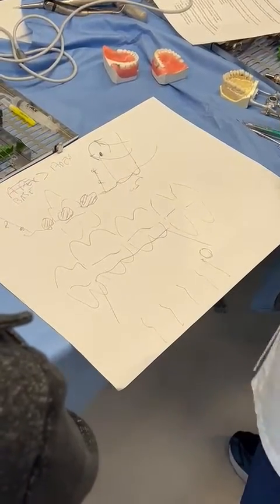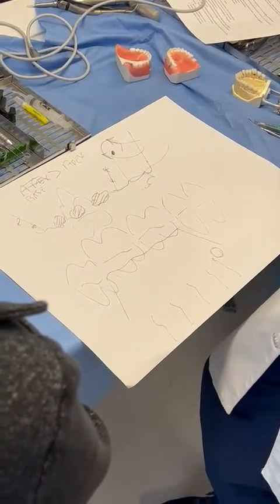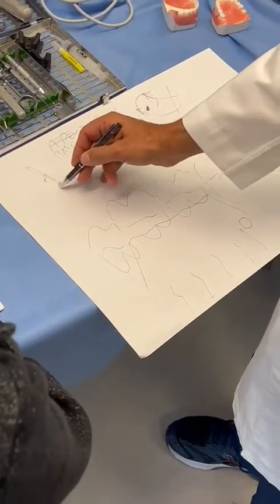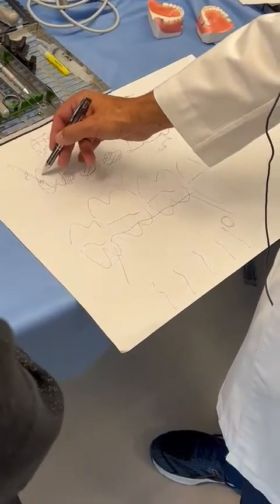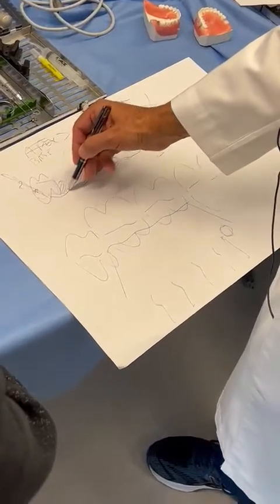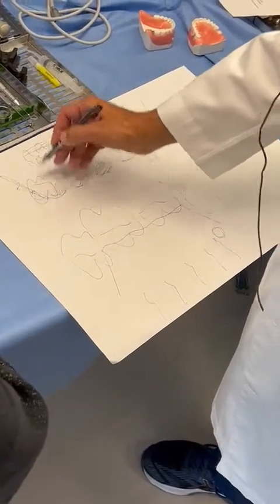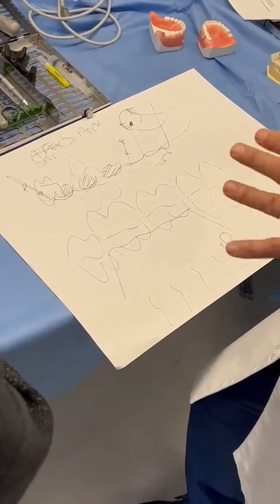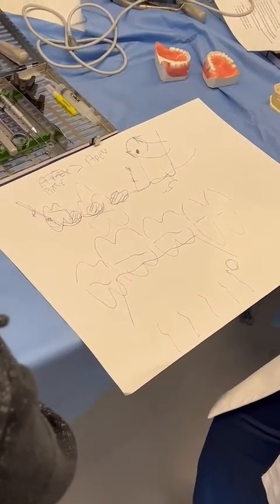Yeah, for an impacted wisdom tooth, we'll do vertical releasing incisions. Absolutely. For back here, might do that. This is here, like this. Okay? You might do that, and then come forward too, and then this comes back, and then you can do like that, vertical release. But for basic dentoalveolar surgery, it's envelope flaps.